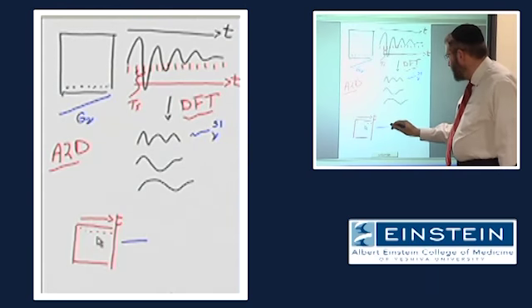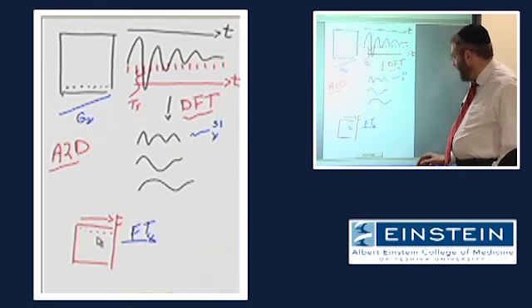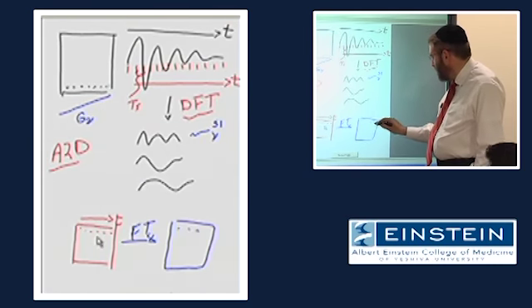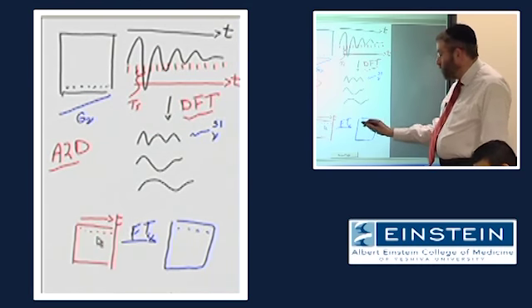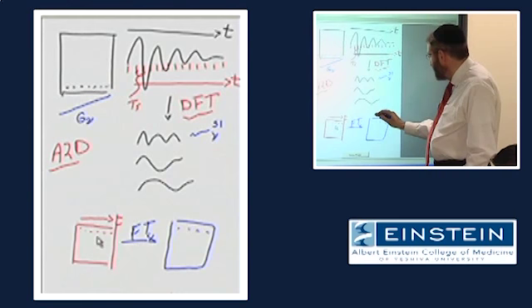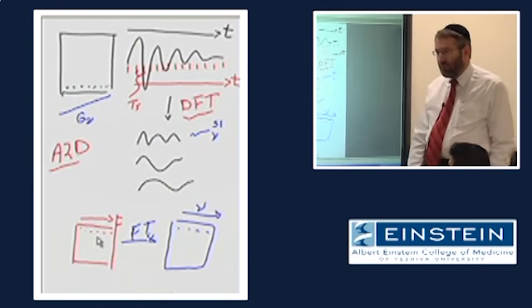Right. So by putting this through our Fourier transform, we can get another series of numbers, which are all measures of signal amplitude. But rather than arrayed in terms of time, they are going to be arrayed in terms of frequency.